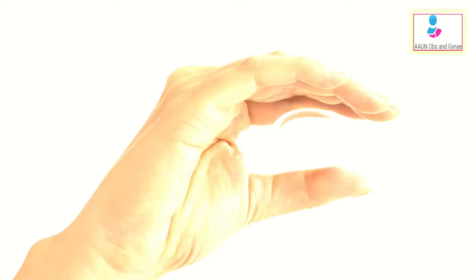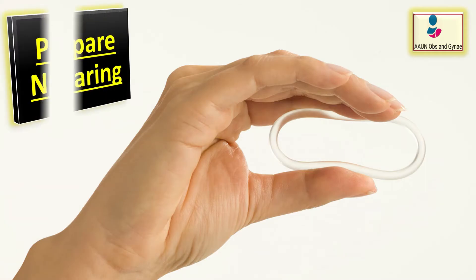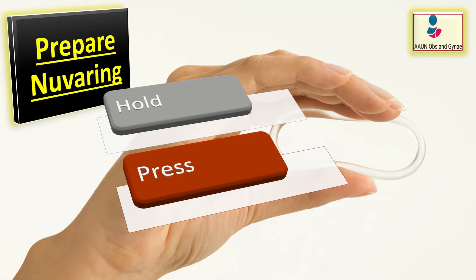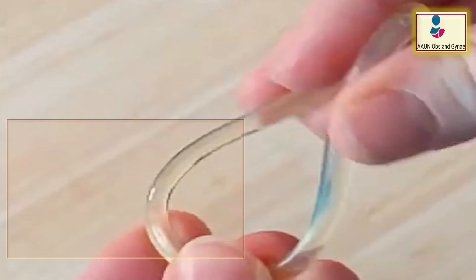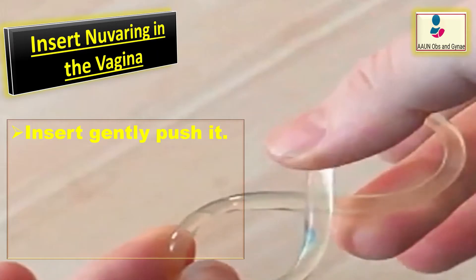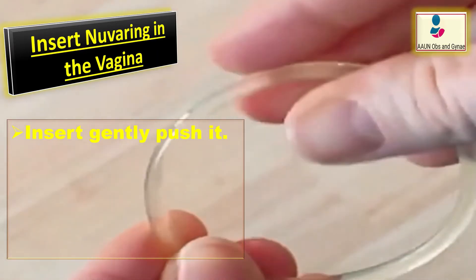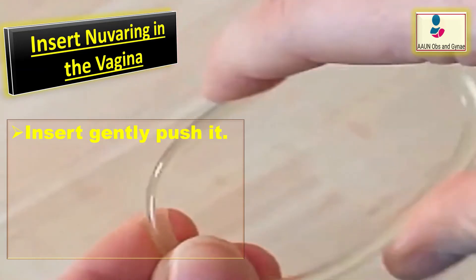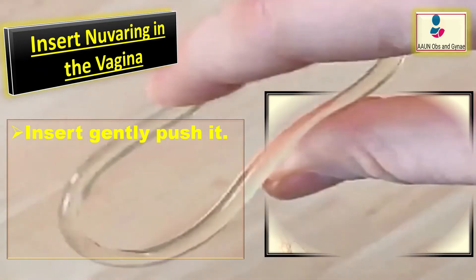To prepare NuvaRing for insertion, hold it between the thumb and index finger and press the sides of the ring together. Then insert the folded NuvaRing into the vagina and gently push it further up using the index finger.